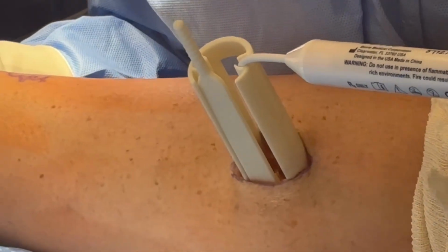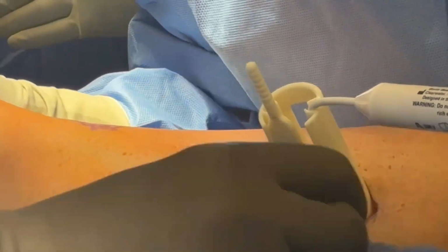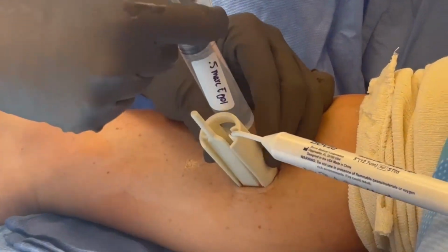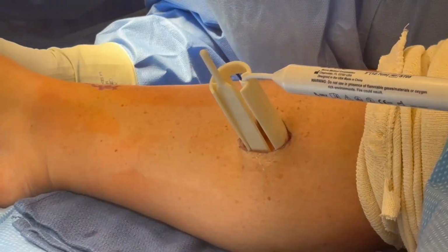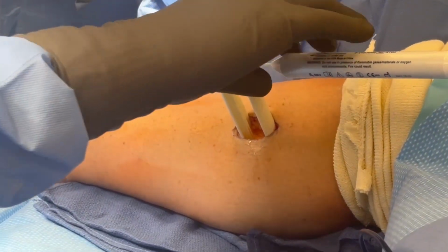If you're not happy, you can do a second recession in the gastroc fascial layer about 1 centimeter apart. And I just like to rotate the cannula to separate out, to spread out a little bit, those 2 incisions in the fascial layer. I would say the majority of the time, just releasing the plantaris and doing 1 recession provides adequate dorsiflexion.